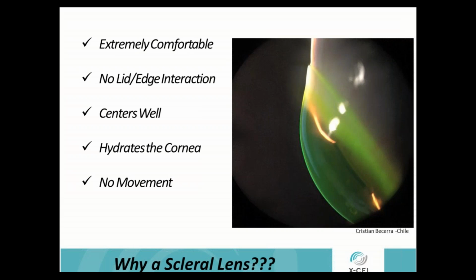It's really good. We'll talk about some of the other conditions, but a dry eye patient, if you think about that dry behind the lens, even with a corneal lens, how that can affect the fit of that lens. Well, with sclerals, we have all that saline and tear behind the lens to hydrate that cornea. Going back to lid to edge interaction, there's very little movement with these. Most of the time, none once that lens has settled, so they won't pop out.